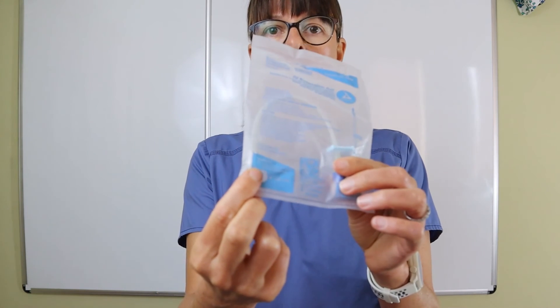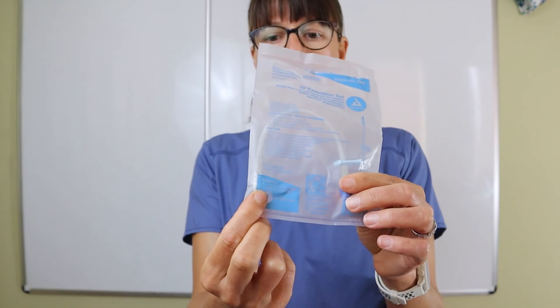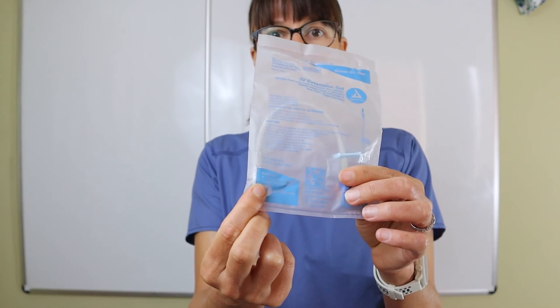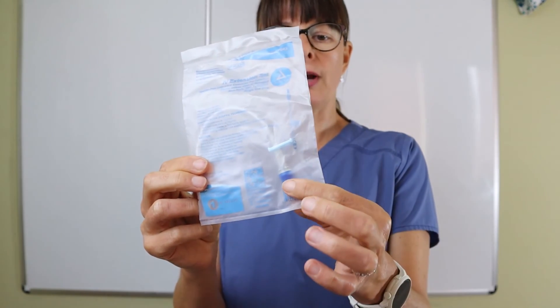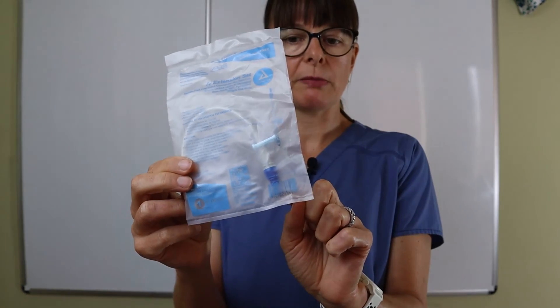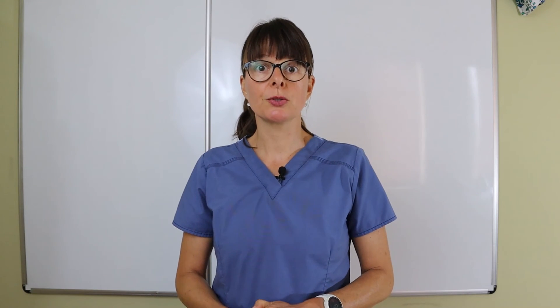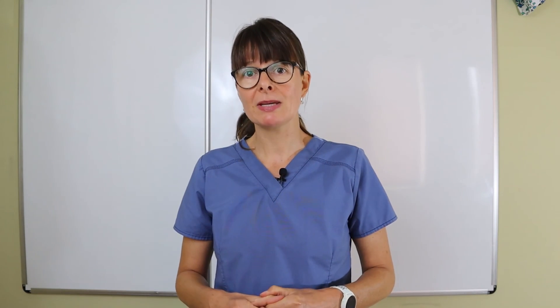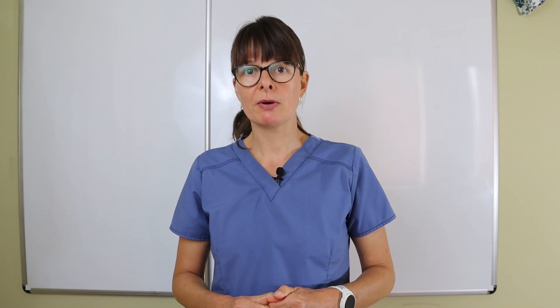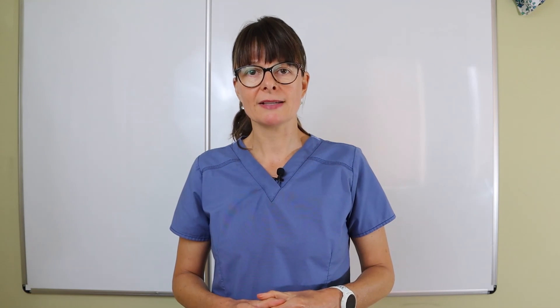This part with the Luer lock will go on to the patient's IV catheter and then be locked here. Then we can hook up the primary tubing right to this port. So these are the most common types of IV tubings that you'll see. Please also check out my other videos where I actually go into priming secondary and primary IV bags and lines.